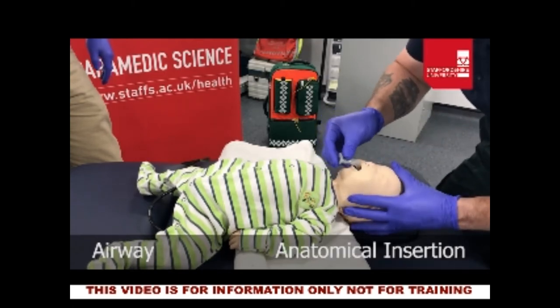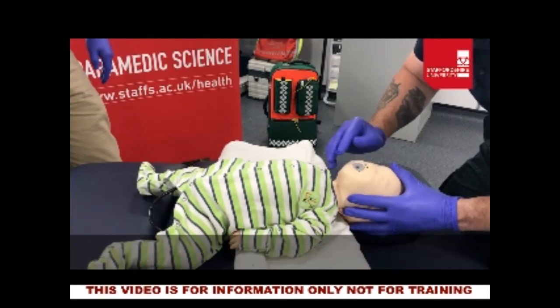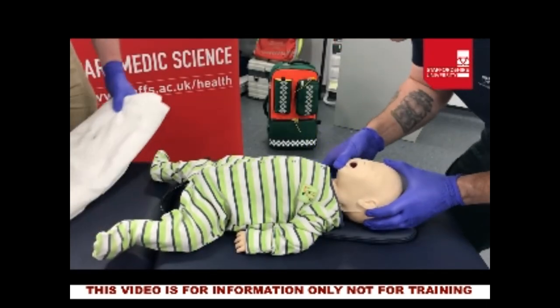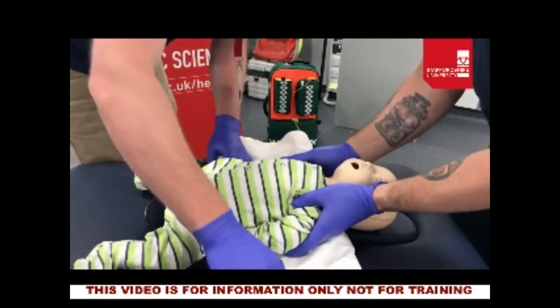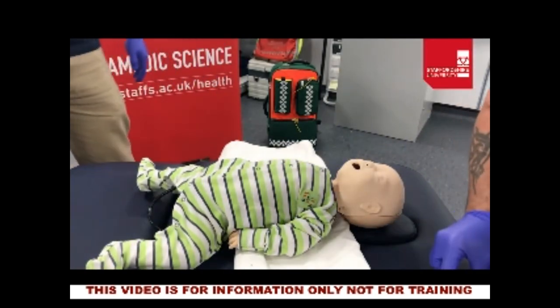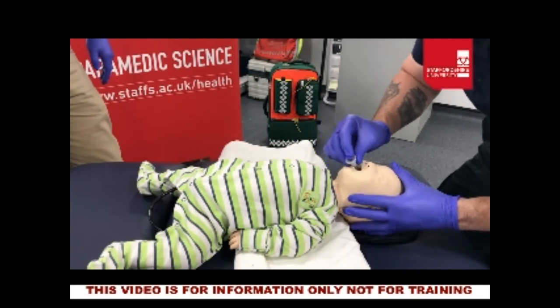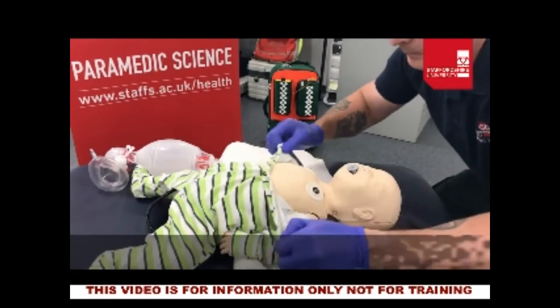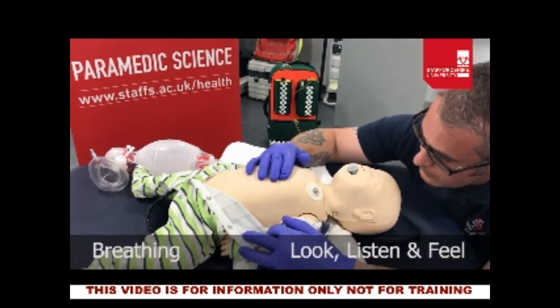Unlike adults, we are going to insert the OPA in a way that follows the anatomy of the oropharynx to avoid damaging the soft palate at the roof of the mouth. In real time, we look in the airway, reposition the patient to put the airway in neutral alignment, size up an OPA and insert it anatomically. Next we expose the patient's chest and look, listen and feel for breathing for up to 10 seconds.